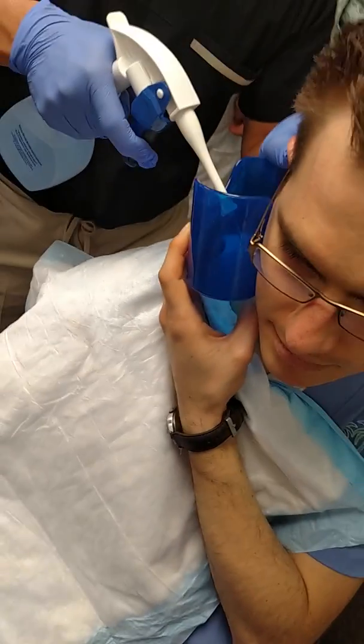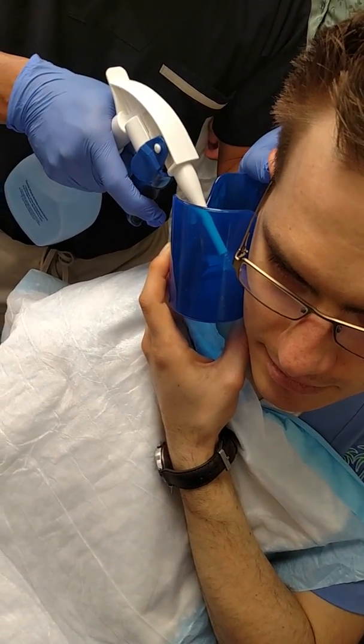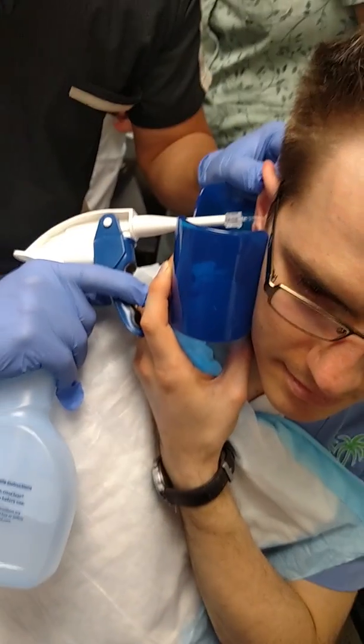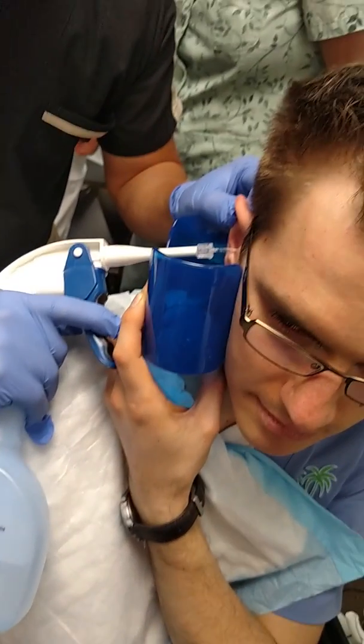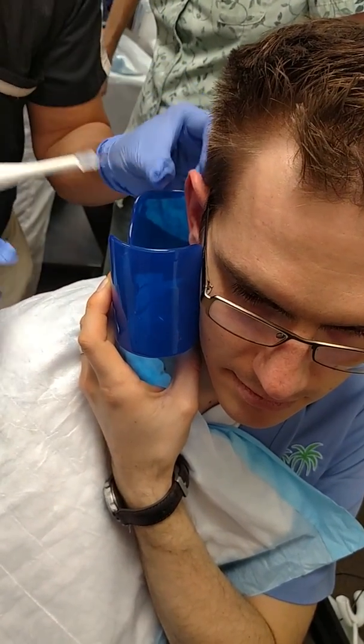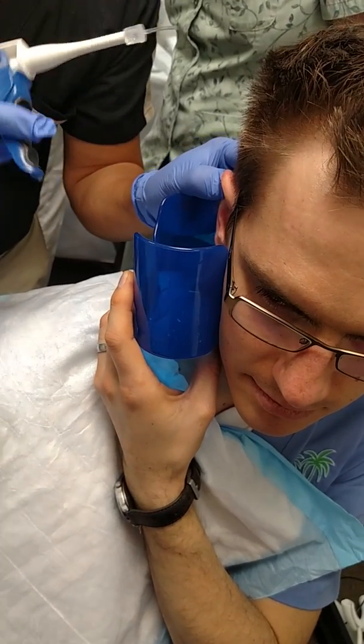You can see that? Not too strong that you would bust the eardrum, but good enough so that the water can just flow into the ear canal, and it is what? It is the pressure, the gravity that pulls out the cerumen. So you have to put it at the roof of the ear canal, not directly into the eardrum, but at the roof. Are you guys with me?